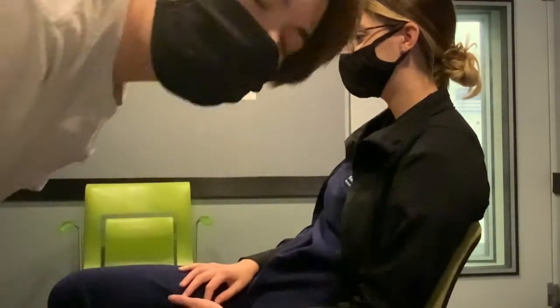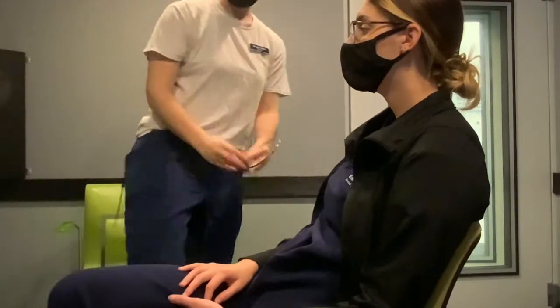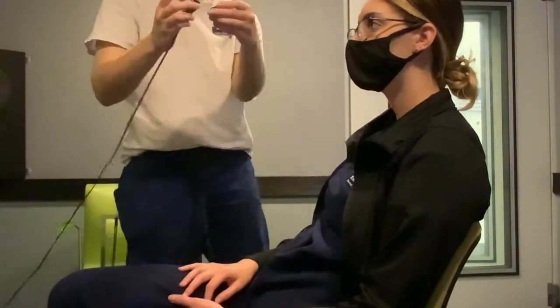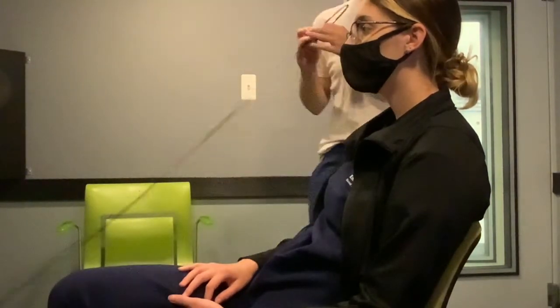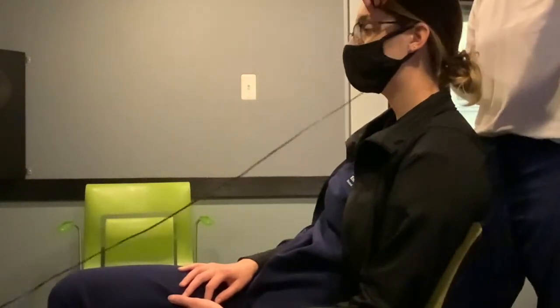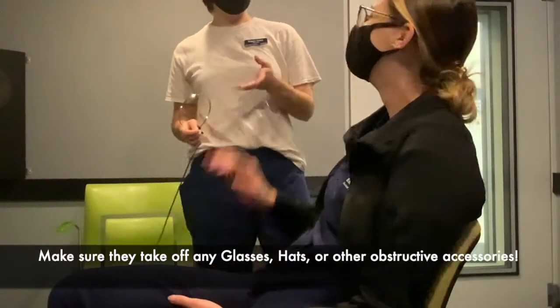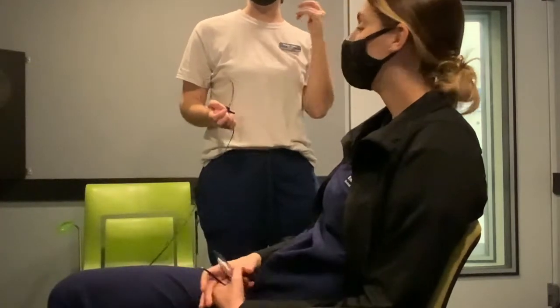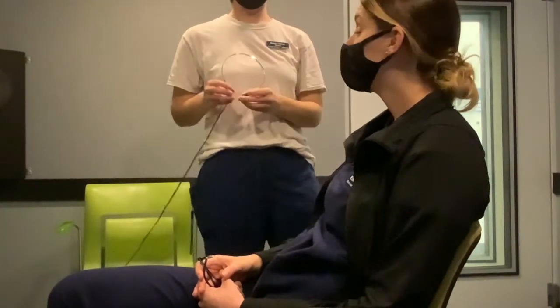So let me put it on, Emily. I'll put it with the oscillator side, or this little machine part over here, next to her or behind her ear, and I'll give you another angle when I'm over here. Could I ask you to remove your glasses for me, please? Yeah. Perfect. You don't want anything obstructing. You don't want the person chewing gum, so make sure you have a nice clear area to work with.